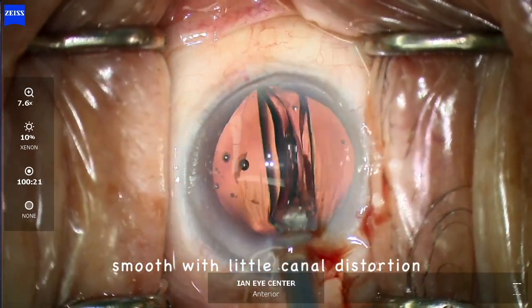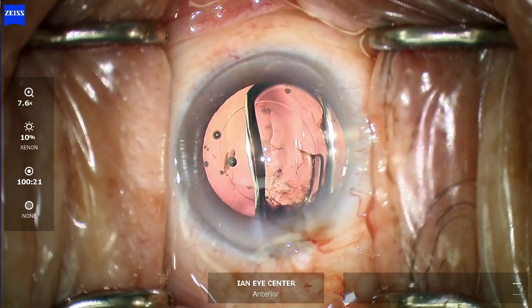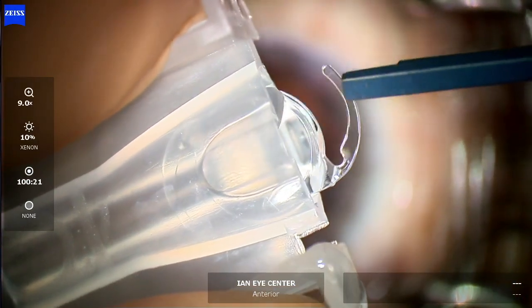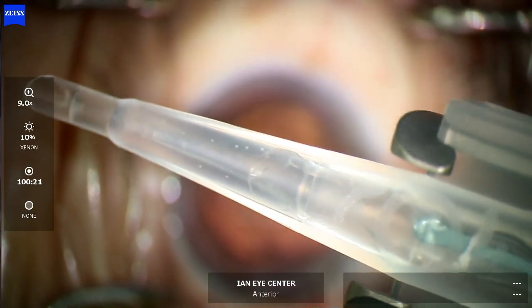The key to this technique is folding the leading haptic in a separate plane from the optic. Additionally, when pushing the folded mass, rotating the lens forceps 90 degrees can facilitate the process.